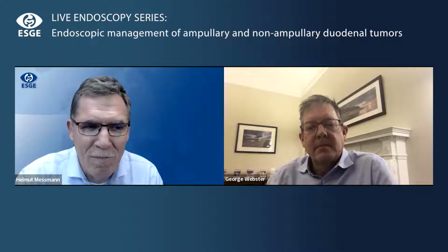We have started a bit earlier today because we planned for 90 minutes, and the idea is to select different centers in Europe transmitting. Initially it was planned live, but because of Corona we will start with pre-recorded videos and showing you detailed procedures, techniques, and so on the developments.